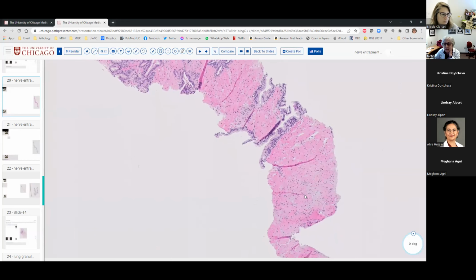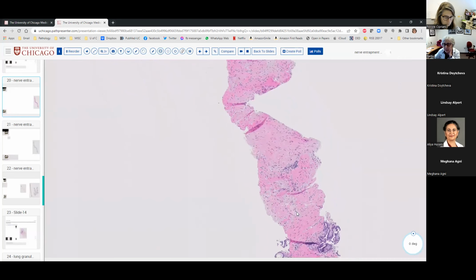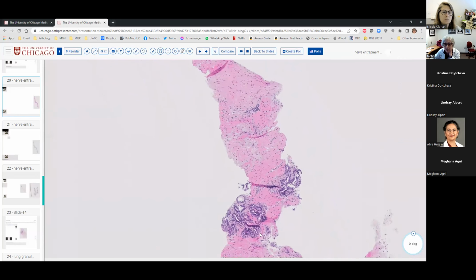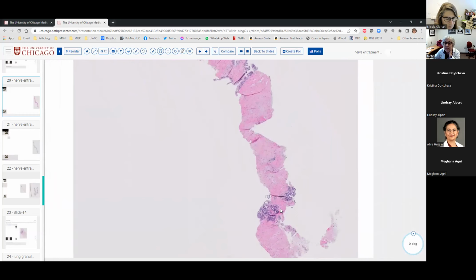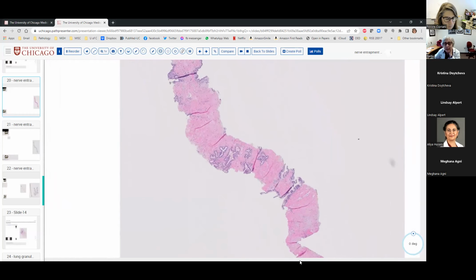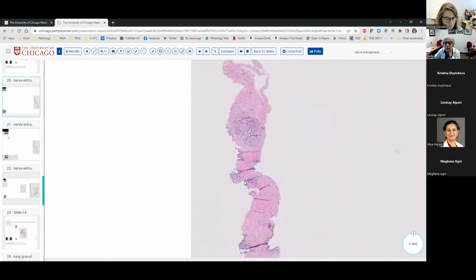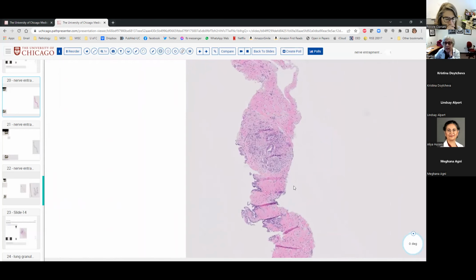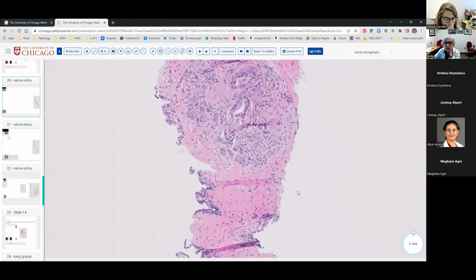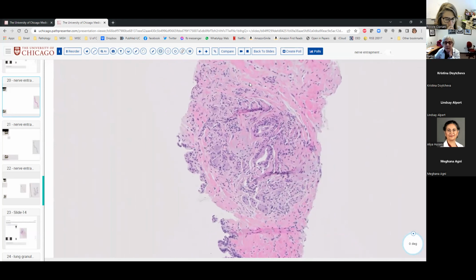Once you assess the architecture in the biopsy, you go to the area that doesn't quite fit that normal appearance of benign prostate. In here, of course, you should recognize the structure that you are dealing with.